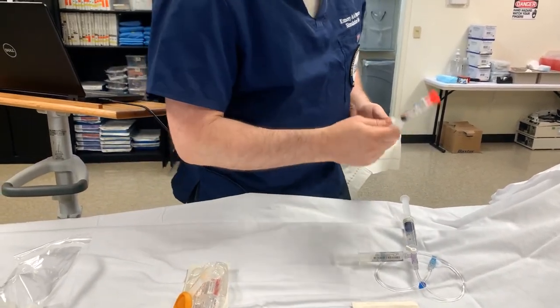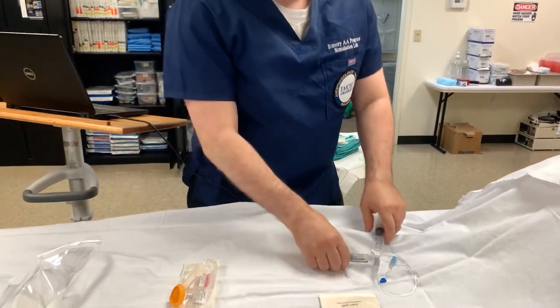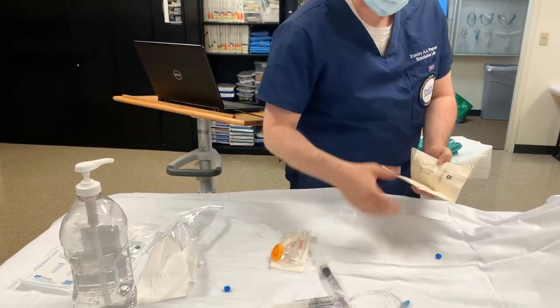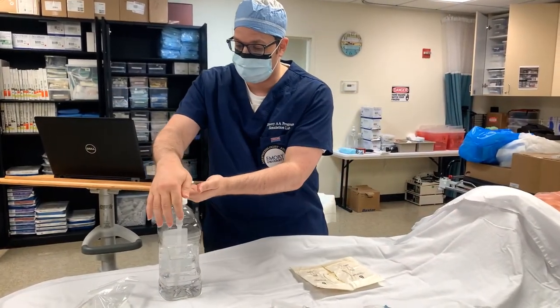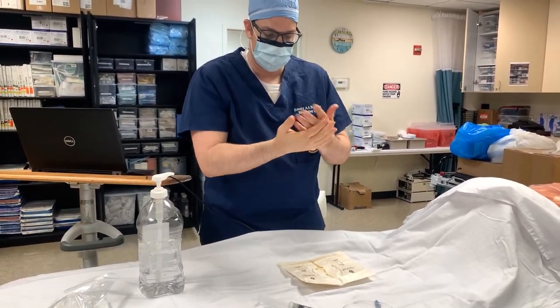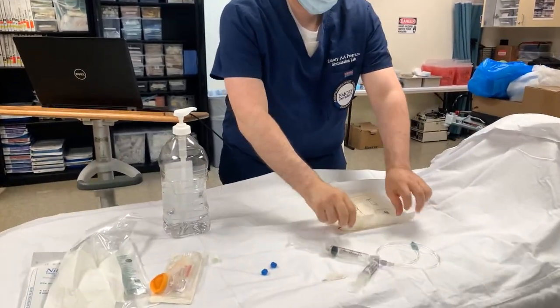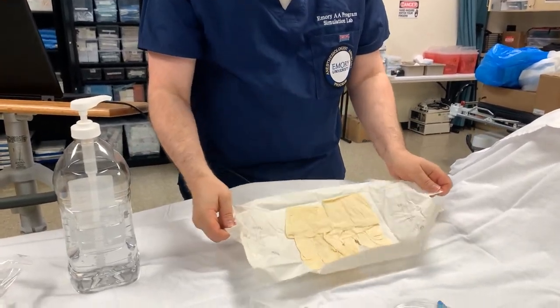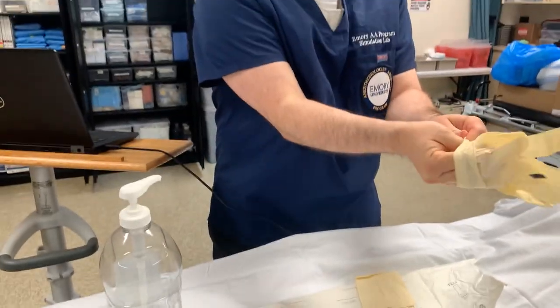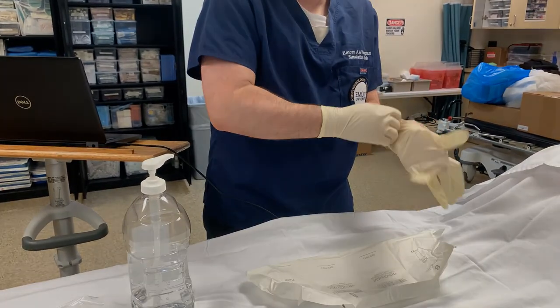I'm going to go ahead and give my patient a little bit of sedation, so I'll ask my assistant to do that for me. At this point, we're ready to go ahead and put on our gloves and get started with the procedure. I'm going to don my sterile gloves, so I'm going to go ahead and clean off my hands.